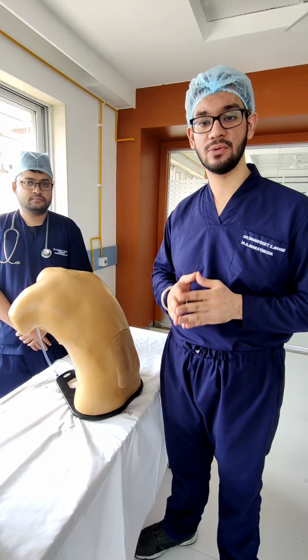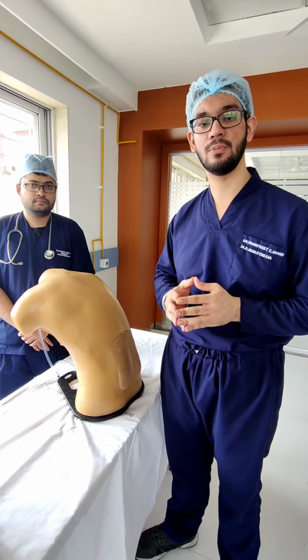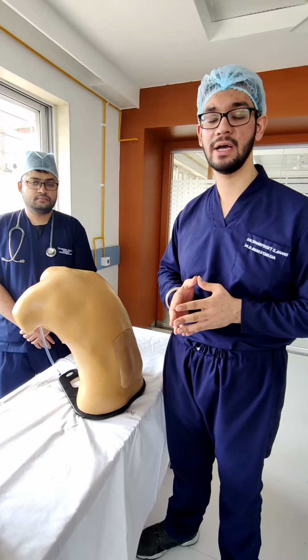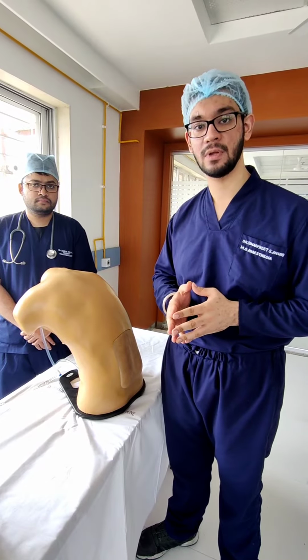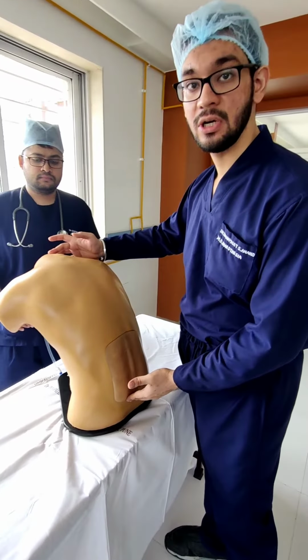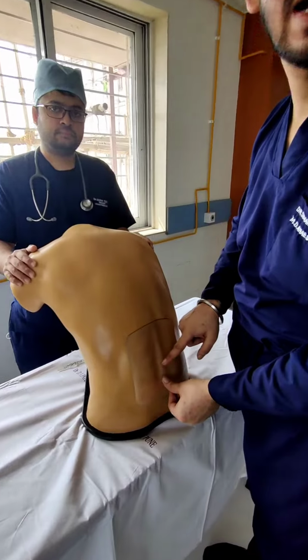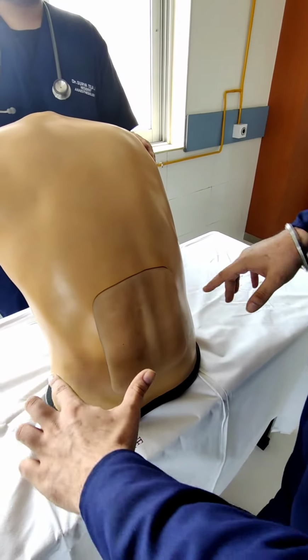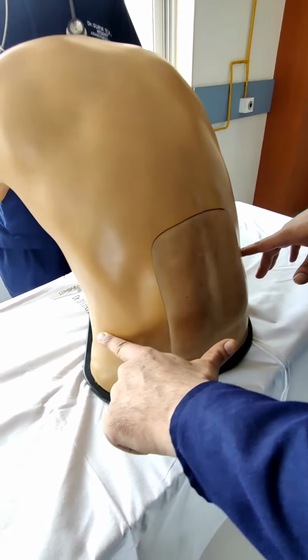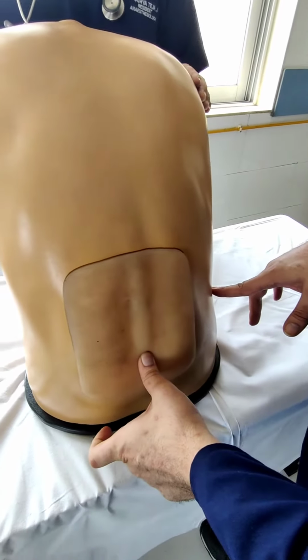After proper patient counseling, proper patient positioning is key for a successful subarachnoid block. We can give this block in a sitting or a lateral position. Anyway, we have to give our patient an arched back position. Giving this position opens the intervertebral spaces and increases the target area as well. We have to palpate the highest point of the iliac crest, which corresponds to the L3-L4 intervertebral space.